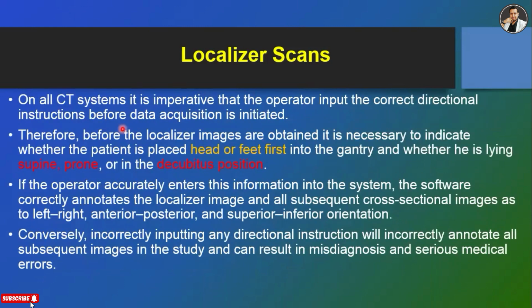On all CT systems, it is imperative that the operator input the correct directional instructions before data acquisition is initiated. That means each CT system must be given a directional instruction. The operator must specify the position of the patient, head first or feet first, before the scan.